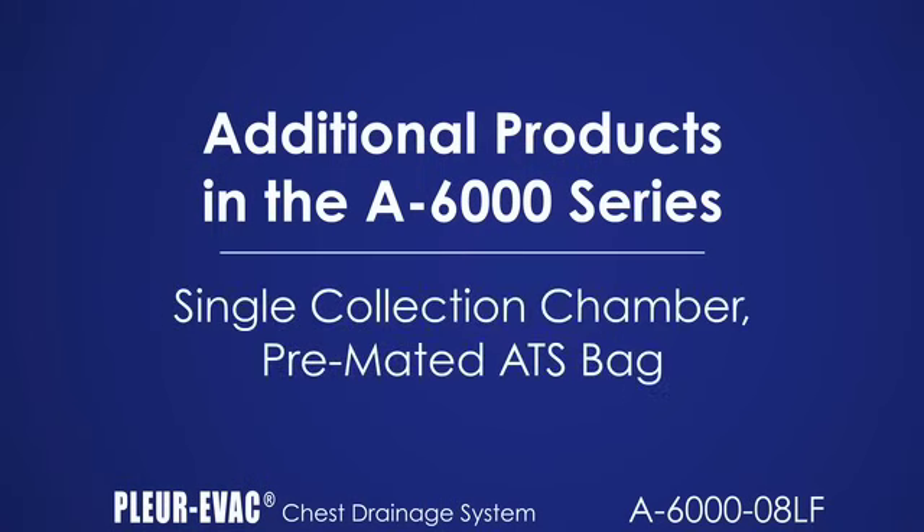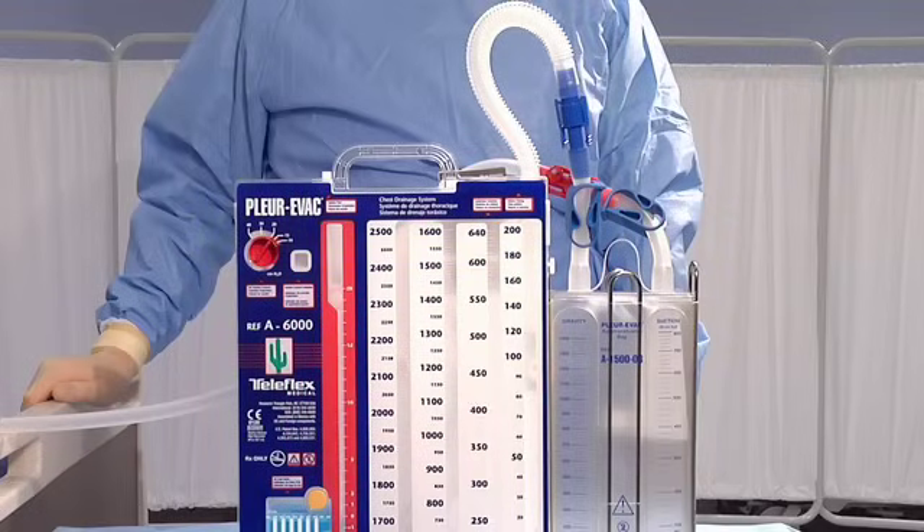The 6050-08LF is a premated version of the A6000-08LF and the autotransfusion bag A1500-08LF. It eliminates the need to attach the two separate products in cases where the autotransfusion bag is anticipated to be used ahead of time.